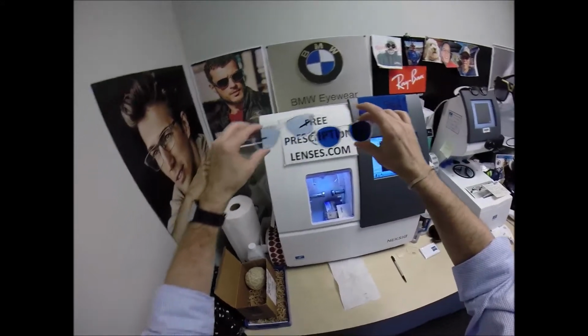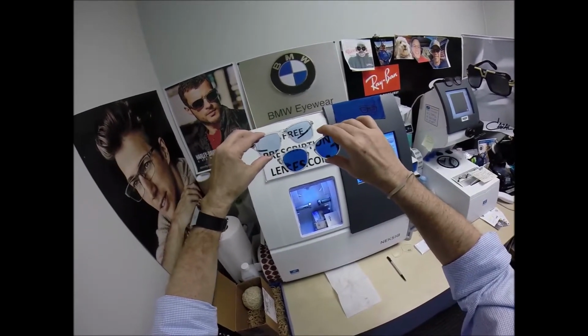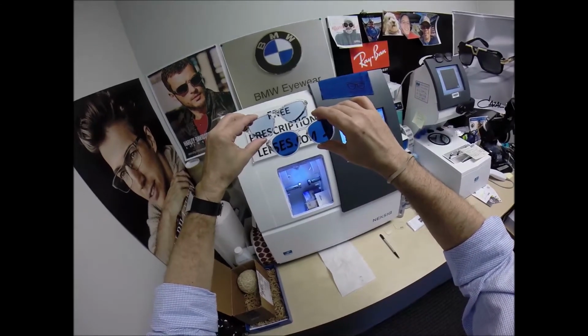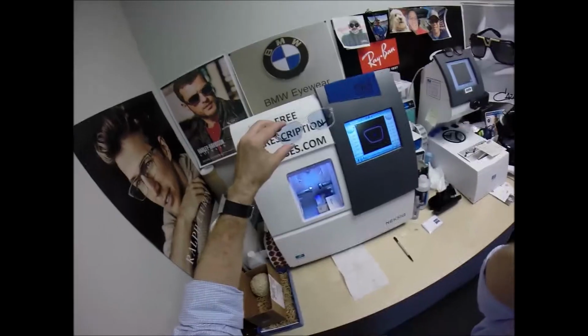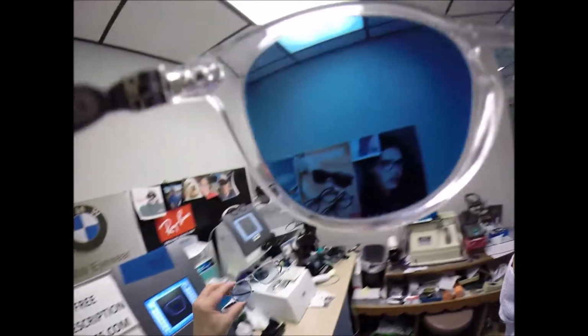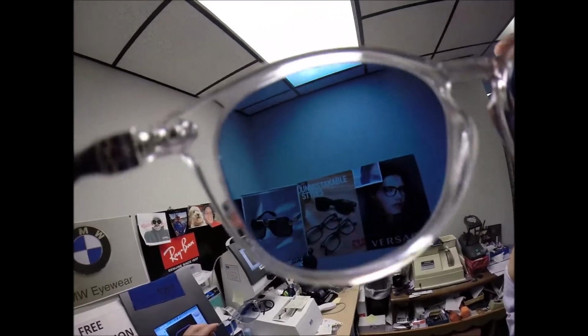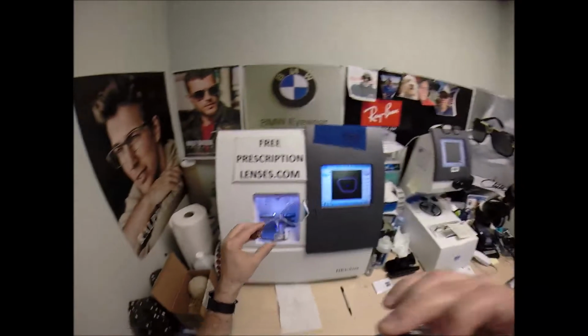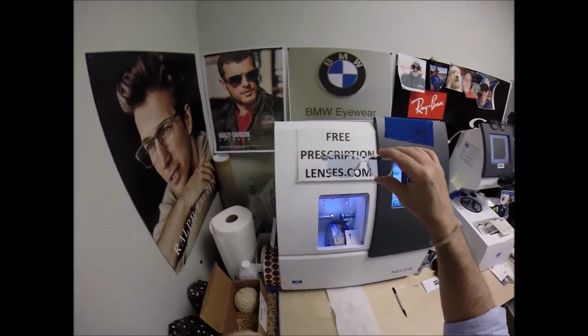You can see what mine look like. That's what these look like about a minute ago in that crystal front. And mine are going to play catch up as they lighten. Put mine back on so I can see. Is everything dark blue in here for you guys? Can you see that? Does that look cool, that blue feature? Or is that just really distorted because you're looking through my prescription? All right, let me put mine back on. But yeah, so that quickly, it's almost back to clear.